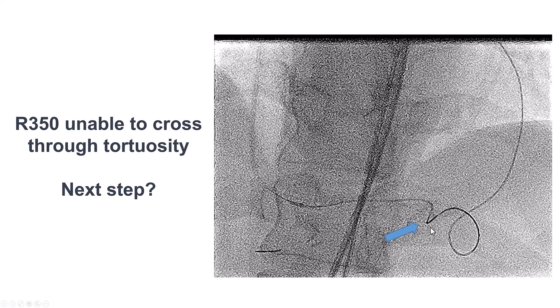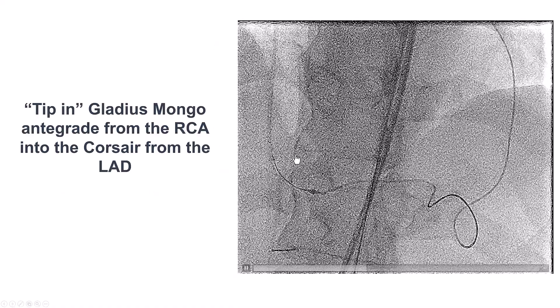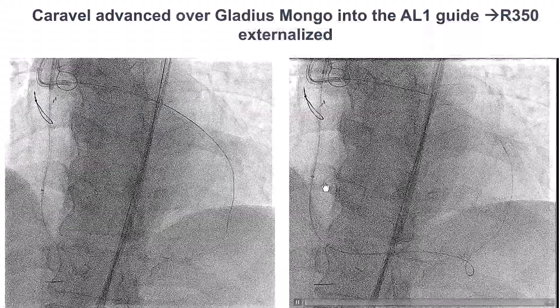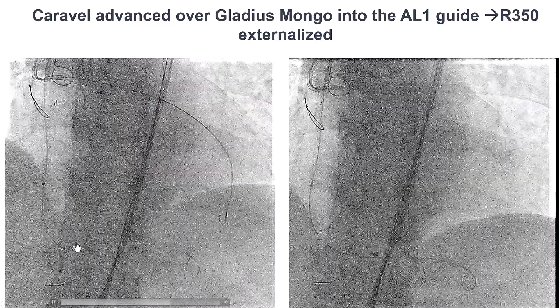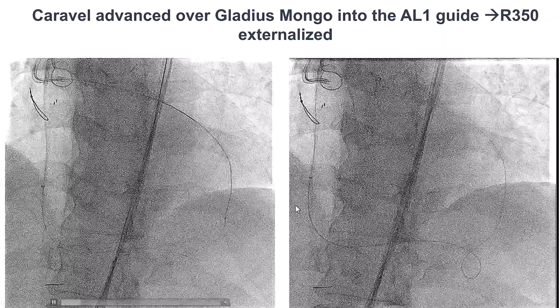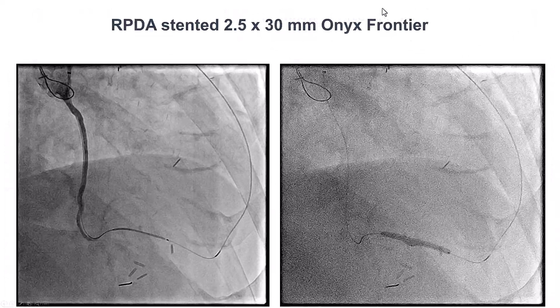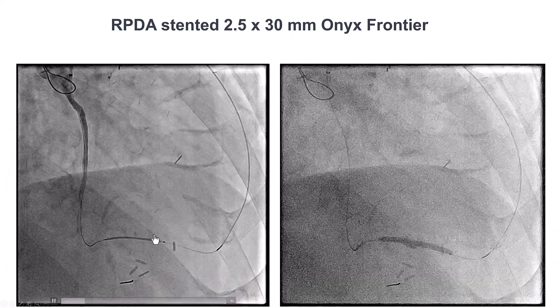The next plan was to advance an R350 externalizer to stent the PDA. Unfortunately, because of significant tortuosity on the distal LAD and the epicardial collateral, we were unable to get the R350 through. So instead, we went antegrade with the Gladius Mongo wire and were able to tip it into the retrograde Corsair microcatheter. After doing that, we advanced the Caraval microcatheter antegrade, and were able to get the wire all the way into the saphenous vein graft and externalize an R350 guide wire. We finally established our retrograde system and were able to deliver a 2.5 by 30-millimeter drug-eluting stent into the PDA, covering the area of dissection.